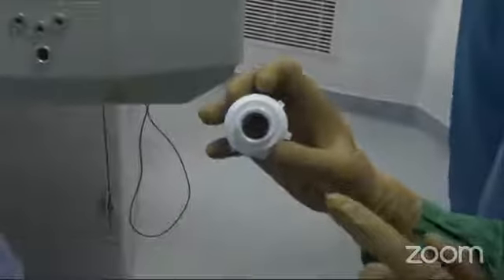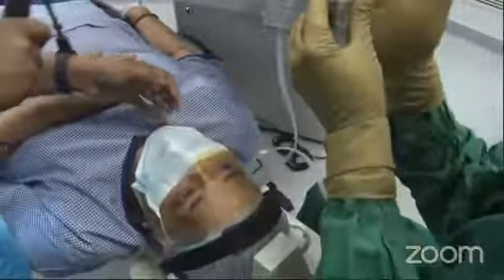Now, you have the patient interface, which consists of two parts. This is the applanation which will go on, but it does not touch the cornea. It is a liquid optic interface and does not cause any folds on the cornea. That is why this system does not give you any folds in the capsulotomy. The cassette goes in for the vacuum — it is hollow — so the patient interface will come into this and there will be fluid between it and the cornea.